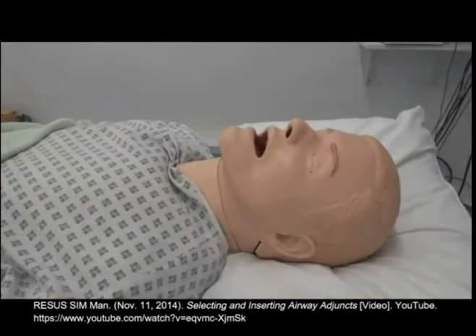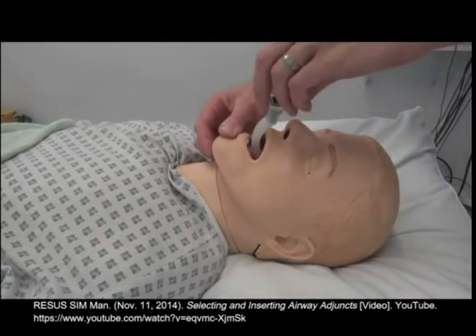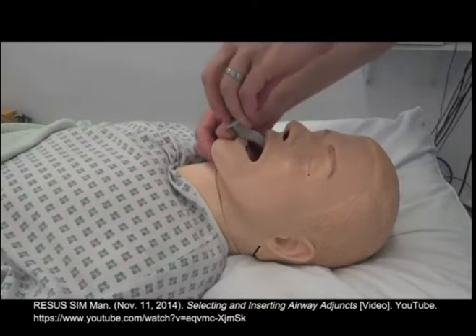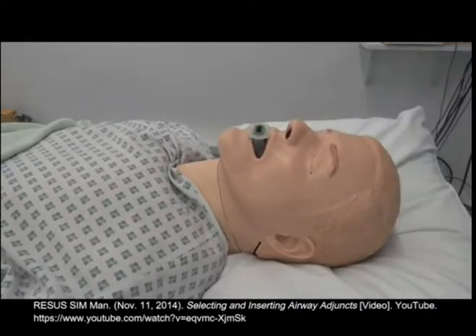To insert the Guedel airway, introduce it into the patient's mouth, with the end of the Guedel pointing up towards the roof of the patient's mouth. Once you advance the Guedel halfway, rotate it through 180 degrees and continue advancing until the plastic base is adjacent to the patient's teeth, or until you meet resistance.